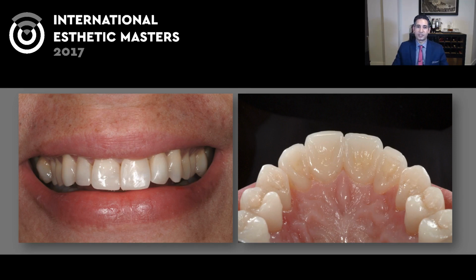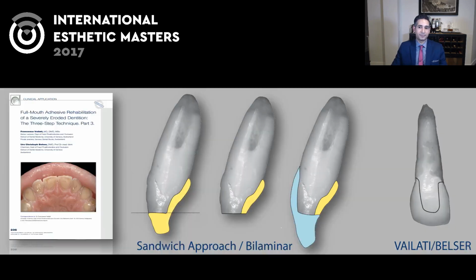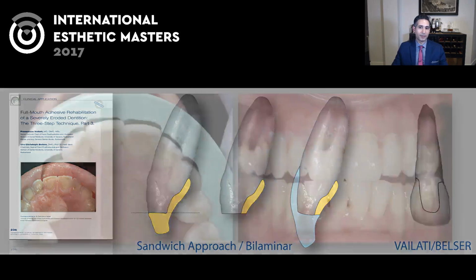You don't always need to go to ceramic on the facial on these cases to get the desired outcome. So here she is with just that incisal lengthening and palatal surface, and you can see it's already a dramatic difference versus how she started. So we did something more like the letter A that you see here with the full proposed final length. And then when we do go prep, we're going to go ahead and prep down back to the incisal edge, and then we're going to leave that lingual composite right where it is on the palatal, and that's going to be part of our sandwich or bilaminar technique to prevent over prepping.